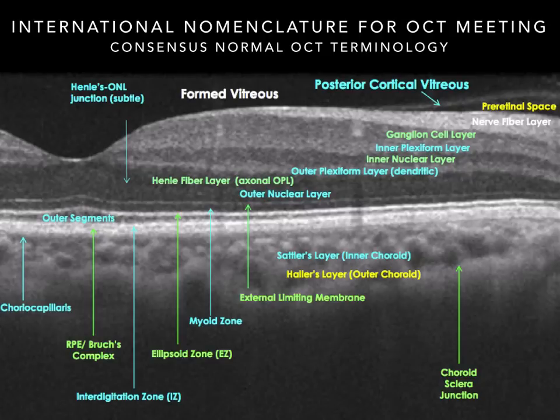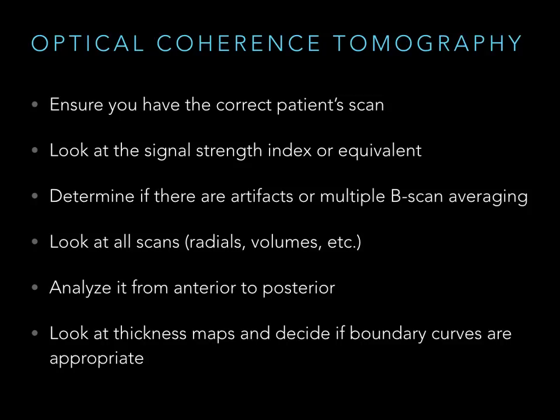But this is probably not spectral domain OCT. I mean, it's spectral domain, but it's probably swept source, which is kind of a subcategory of spectral domain. Uses a slightly different technology that's awesome. Okay. Next slide. All the rest of the slides are not nearly as great as that slide for the whole lecture.